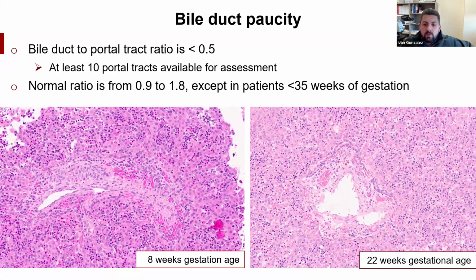How to do the count? You can do an H&E or you can get a CK7. I personally do it in my H&E, also in the trichrome and in my PAS with diastase. So I do it in 3 separate slides. And the reason I do those 3 slides: one, the PAS with diastase is actually a very clean slide to review liver. And because the basement membrane will be highlighted in the bile ducts, it makes it easier sometimes to find those bile ducts. And the other reason is that, knowing how my lab cuts the slides, they are in 3 different levels.